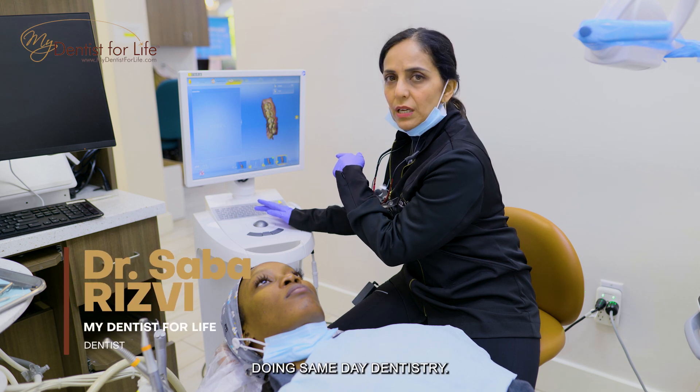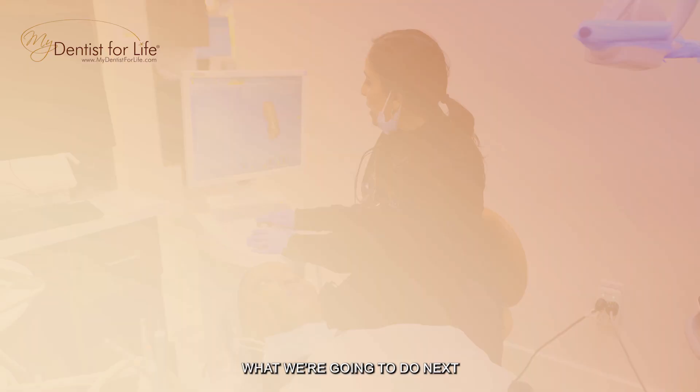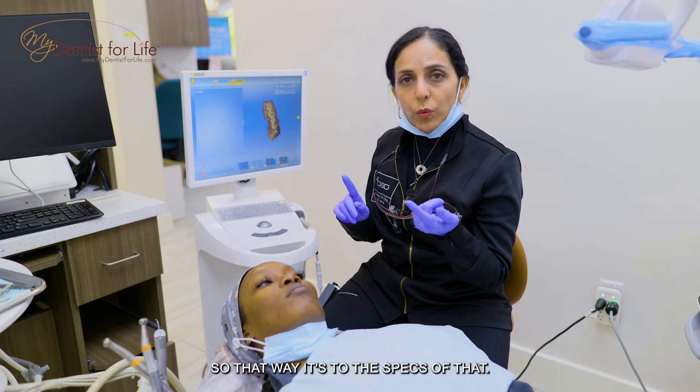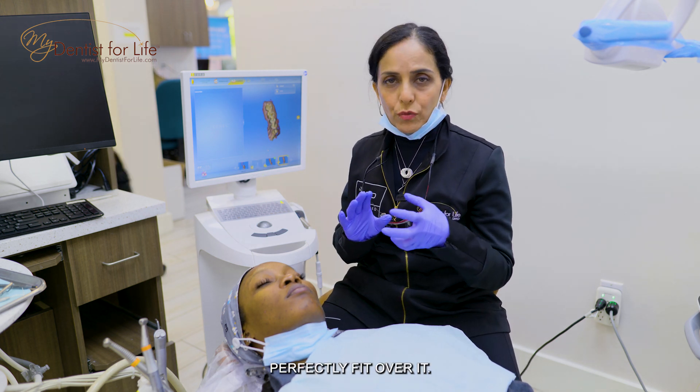What we're doing is same-day dentistry. We got the scans of what we are starting with. What we're gonna do next is prepare the teeth to the specs so that a crown can perfectly fit over it.